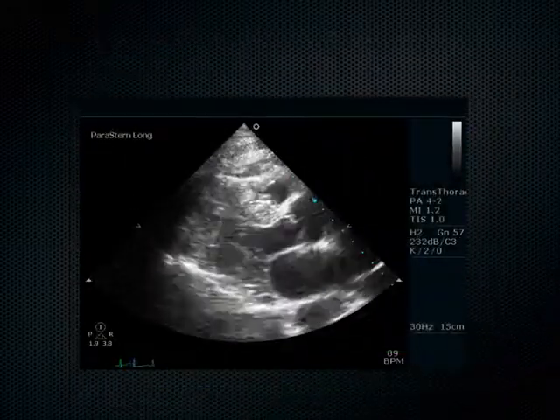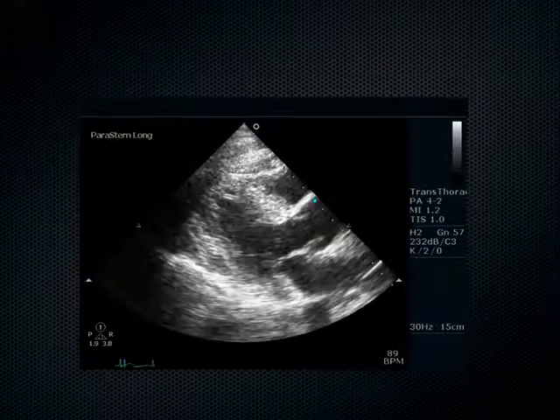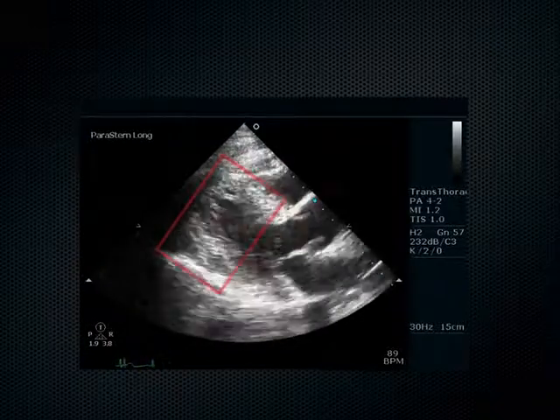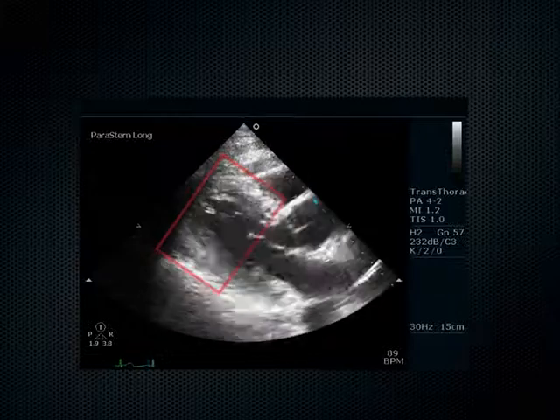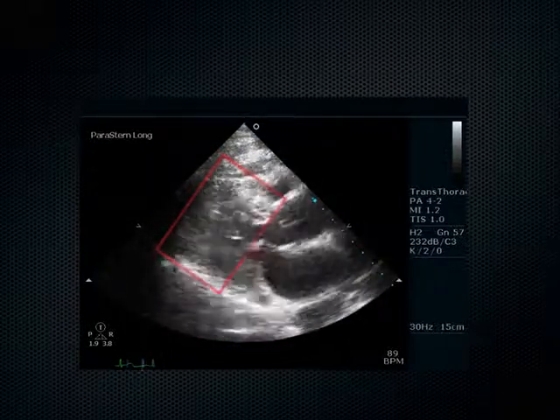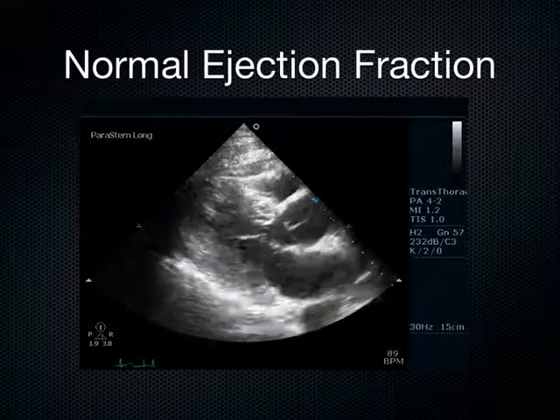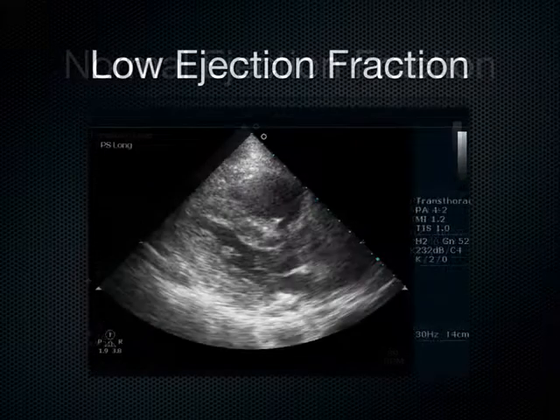How about this next one? Okay, septal leaflet coming up. Pretty good, hitting that septum pretty well. Okay, good sequentiality going on. How about the LV and the interventricular septum? Yeah, the heart is emptying with each beat. See how they actually touch each other there. And when they touch each other like that, and this patient's blood pressure is 70, I know that I need to right away get some fluids going, right? This is a dry heart. It needs some fluids. A normal EF, that's a very thirsty heart.